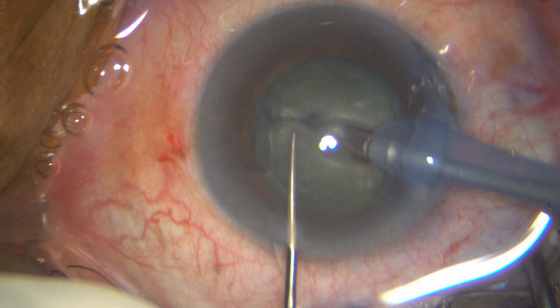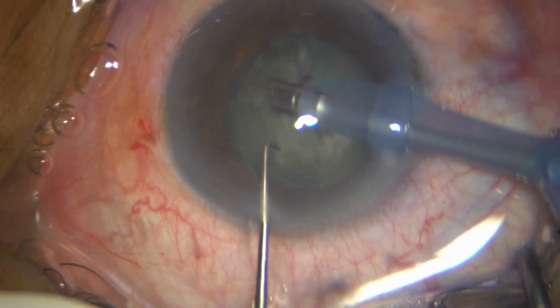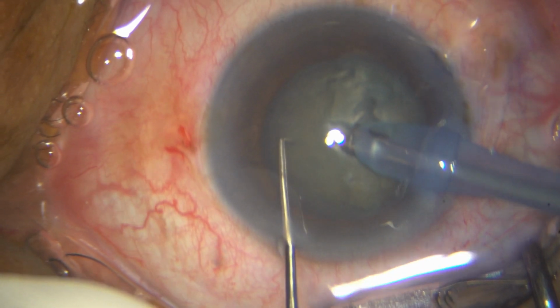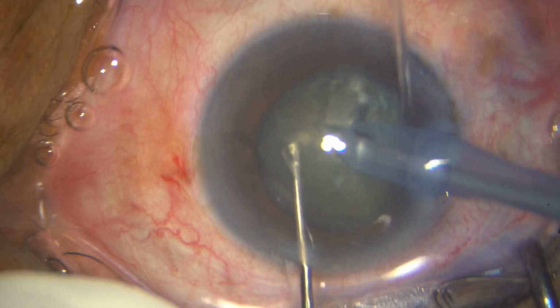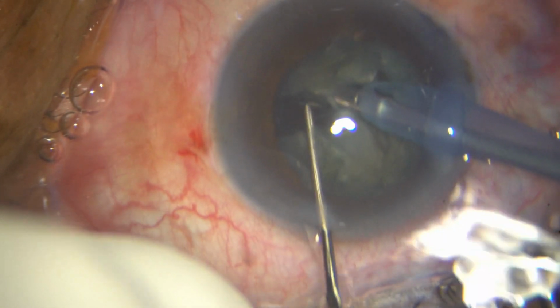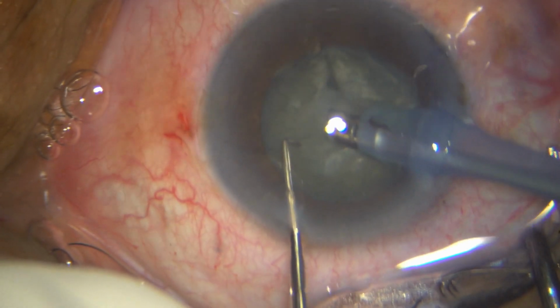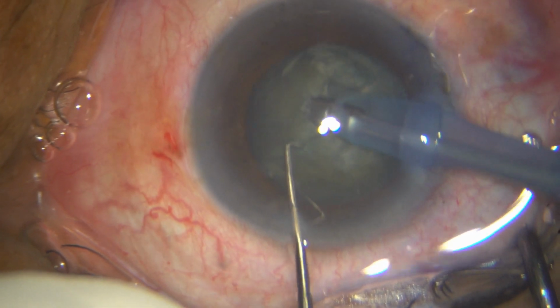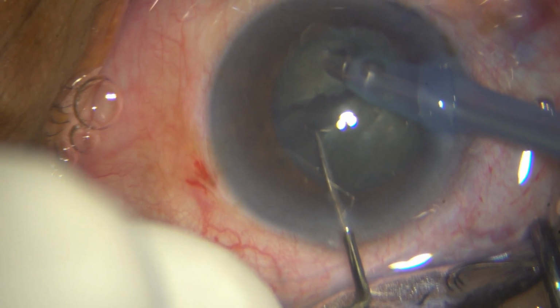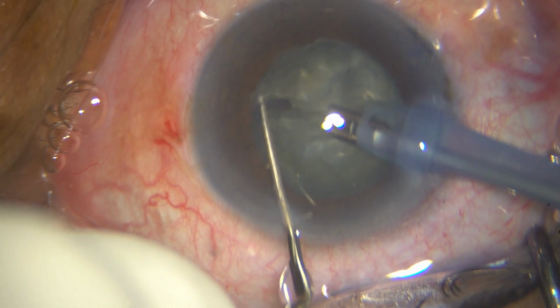In this particular case, I have got around 50 to 60 ultrasound power. Of course, I am not using all of it, hardly using half or more of it. And the phaco mode is in continuous mode. I do not change these parameters both for segment creation and removal. So the important thing is to have a clean break throughout, so you try and avoid that backbone forming.